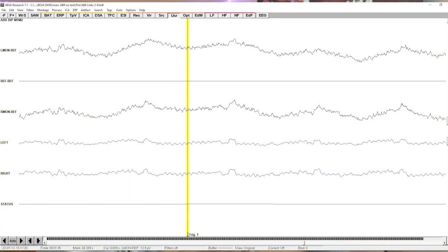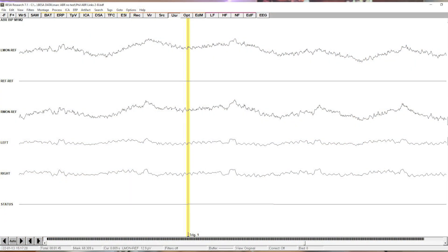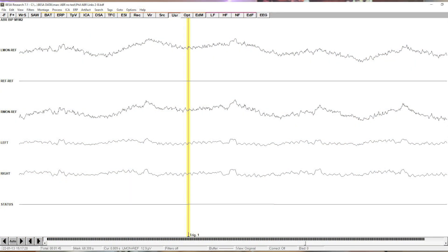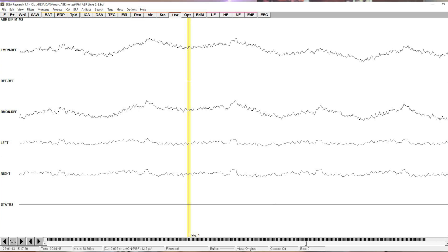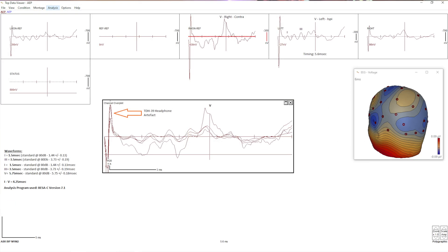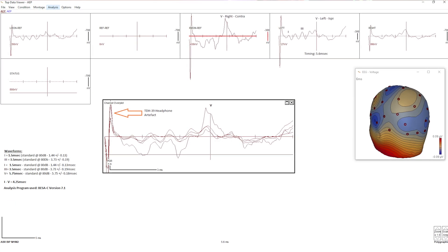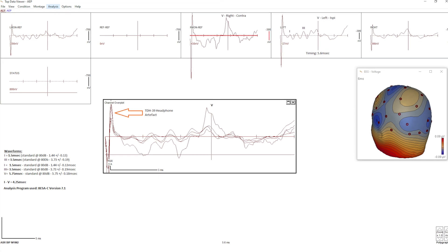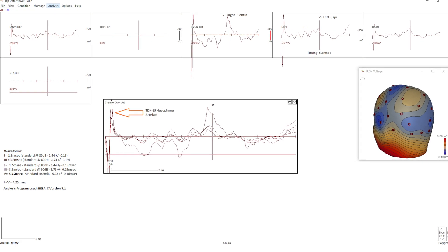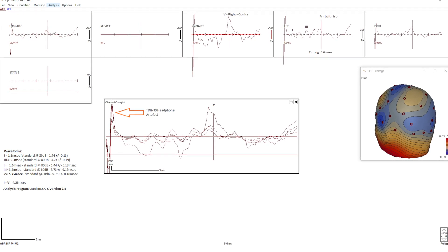In the Beza analysis software, as an example, an average of the ABR around these received triggers — 256 averages — can then be comfortably achieved without having to compensate for a possible delay, as there is none.